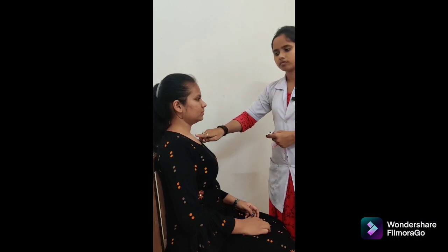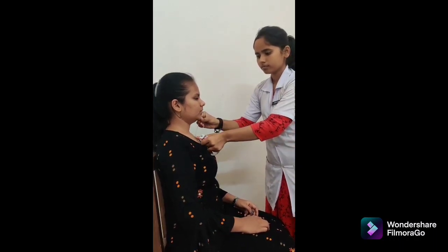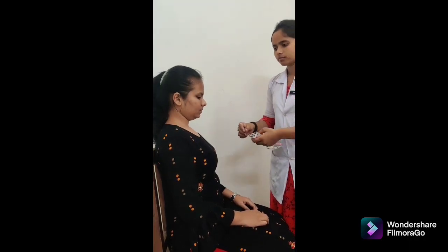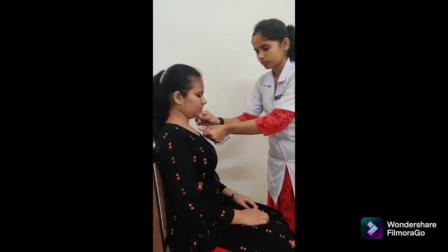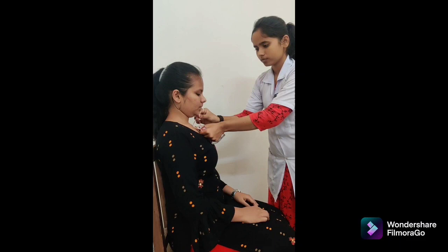We are going to perform cervical flexion with tape. Patient position: high seating with thoracic and lumbar spine supported by back of chair. Tape alignment: place one mark over the tip of chin and other on the sternal notch. Measure the distance between tip of chin and sternal notch. Instruction to the patient: bend the head forward and downward while keeping the trunk straight. Measure the difference between beginning and end of range of motion. Normal range: 1 to 4.3 cm.